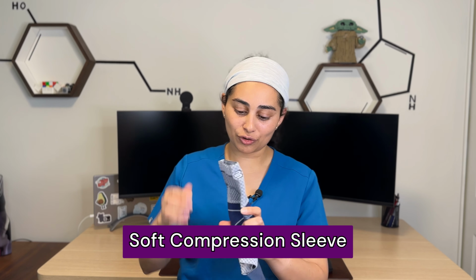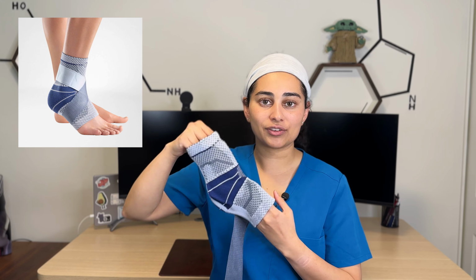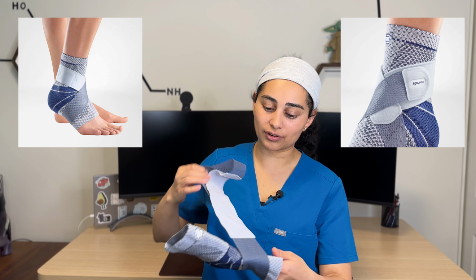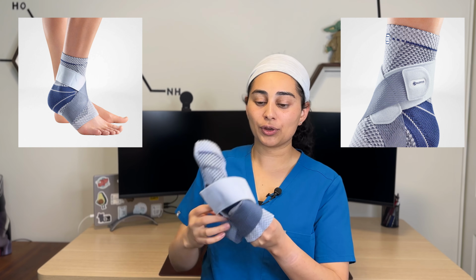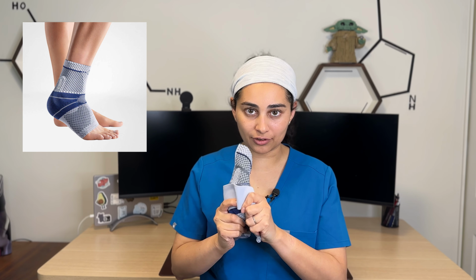Today, I want to review the different options available to patients for foot and ankle braces and what conditions I recommend them for. So the first and most common type of brace that you'll likely see for the ankle is a soft compression sleeve. So basically, you put your ankle in this and it provides an added level of compression. This model here also adds a little bit more support because you can actually then also wrap it with some additional level of compression. So there's kind of two grades here. Usually you can just get a compression sleeve. This one also has that added strap.